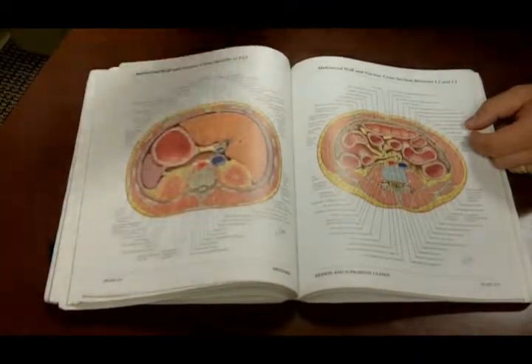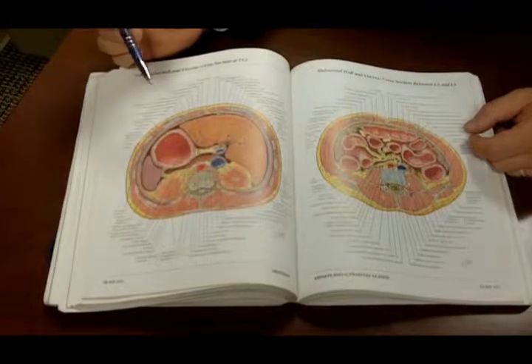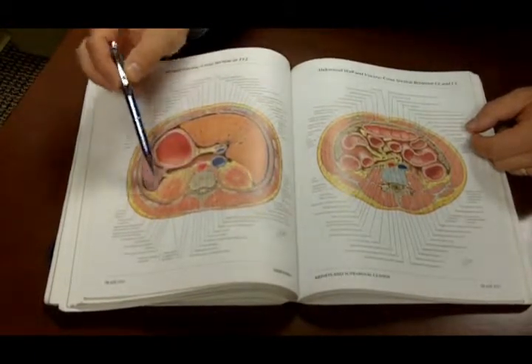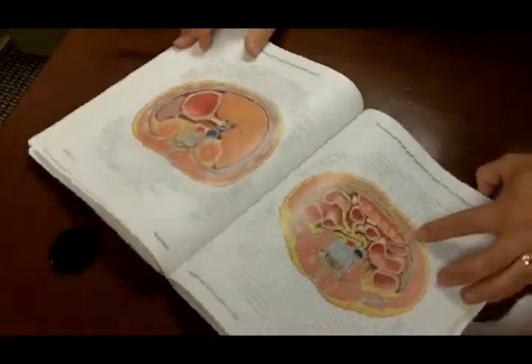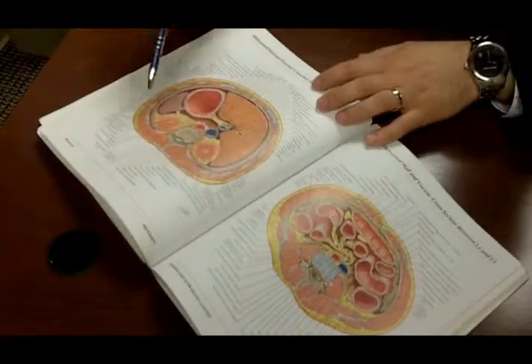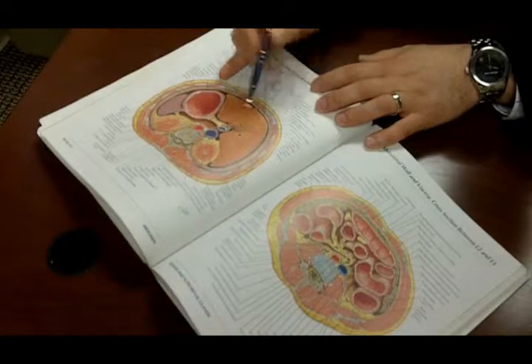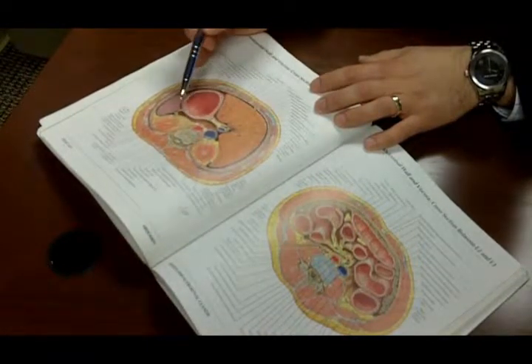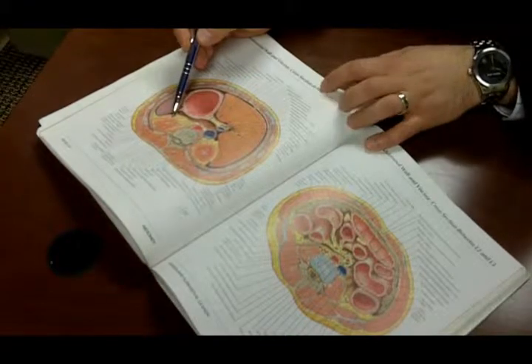And if you think about this three-dimensionally, the patient's bowel would also be in the way. So all of these structures need to be rolled. In fact, the patient would be laying in a position like this, so that these structures can more easily be rolled this direction away from the adrenal gland, which, sitting on top of the kidney, would be the last structure that would be encountered.